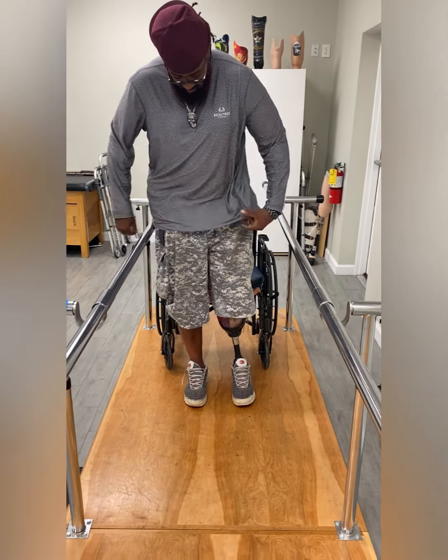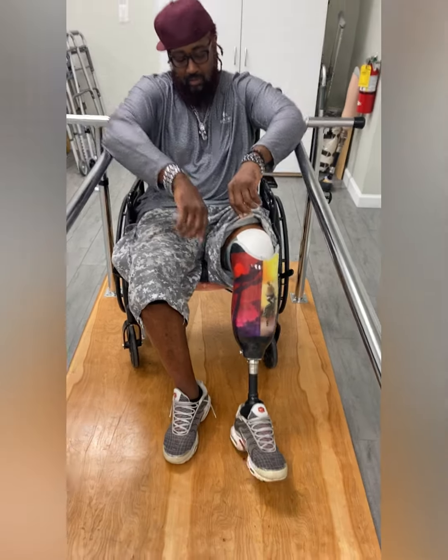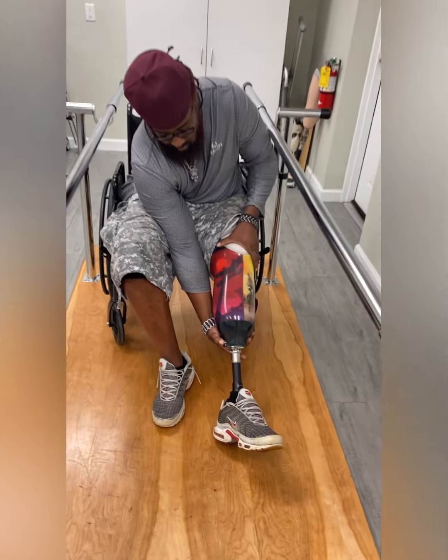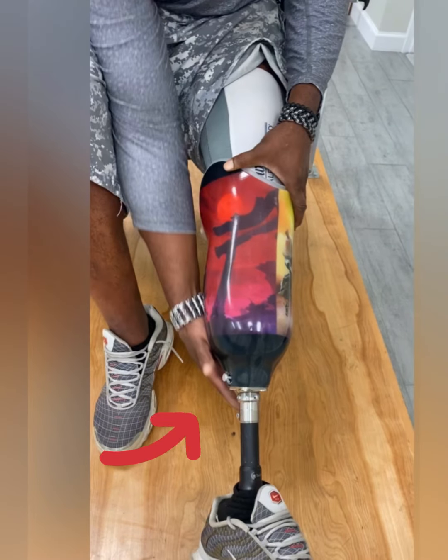To remove your leg, simply sit down or be in a safe position. Press the button in on the side and hold it in while you slide your limb out of the socket. The release button is typically on the inside of the socket, but yours could be in a different spot depending on your setup.